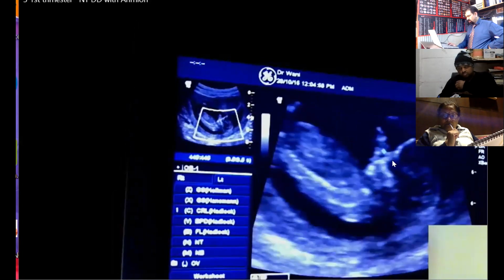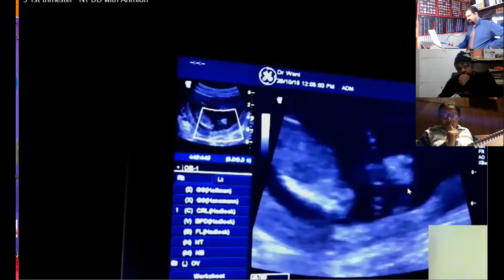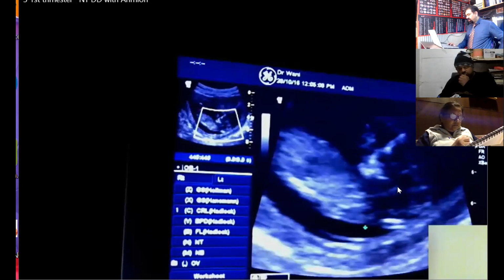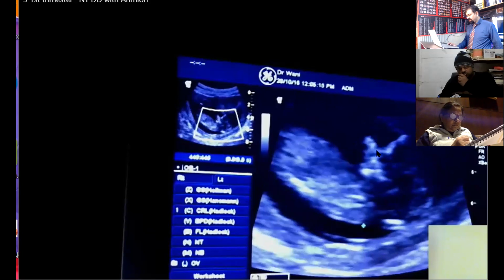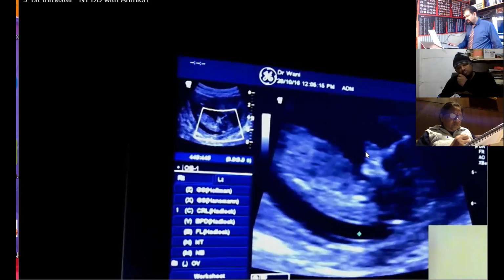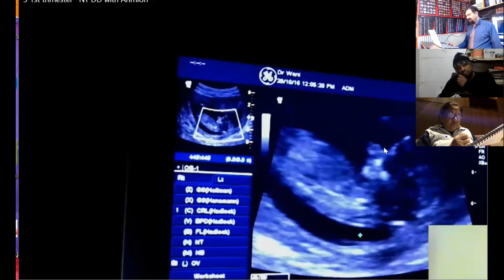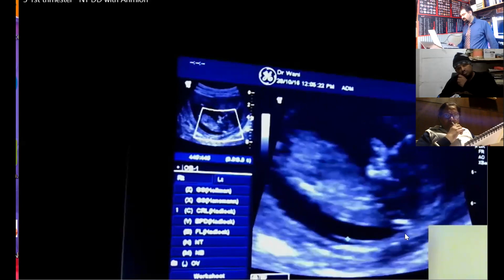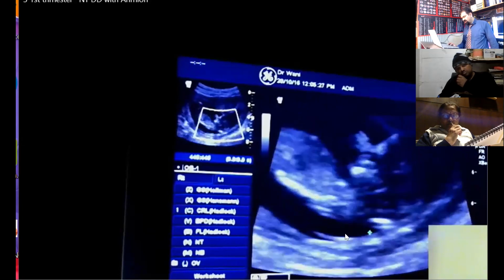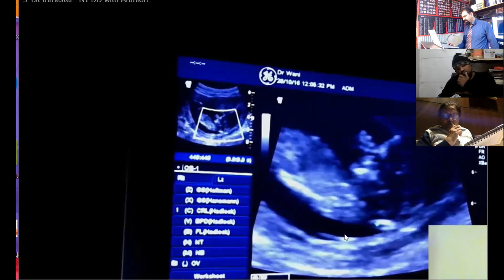This is the point. So the fetal nose is over here, not clearly in this plane. Now this is coming in between. And the important point is that you should not see the fetus waving at you, and don't measure this because this is the nasal tip over here. The nasal bone will be over here. This is the nasal bone, and that was the fetal nasal tip. So we are right now discussing this amnion, and we are waiting for the movements if they happen.